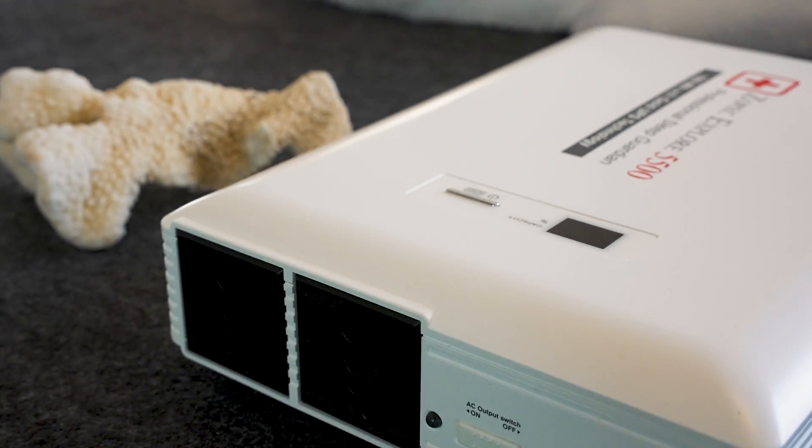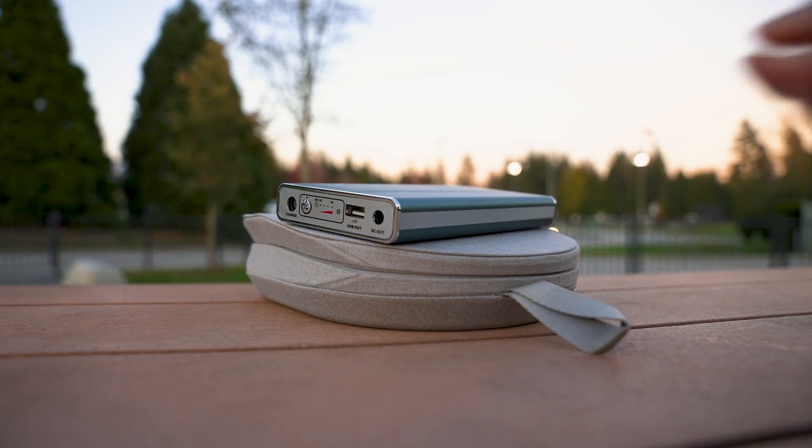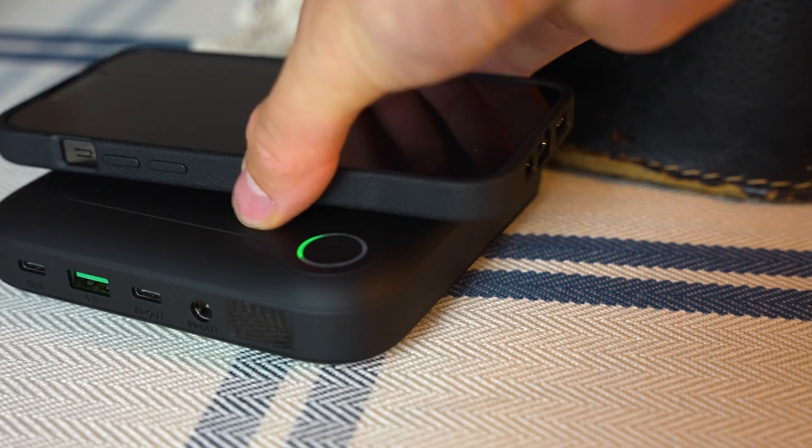Hi everyone, Tristan from the cpapstore.ca here. Bit of a different video today, it's kind of a weird one. For the past few weeks — I'd say three weeks — I've been working on putting together a really in-depth CPAP battery video to give people a good understanding on capacities and run times and what type of performance they can expect out of different CPAP batteries on the market.